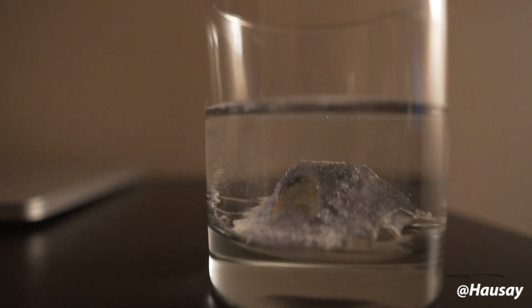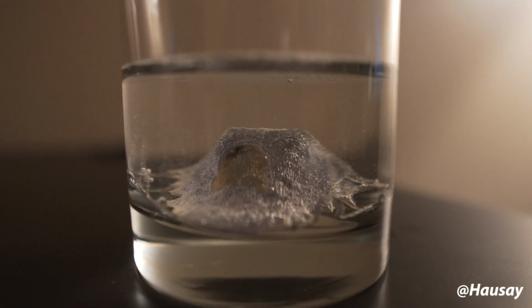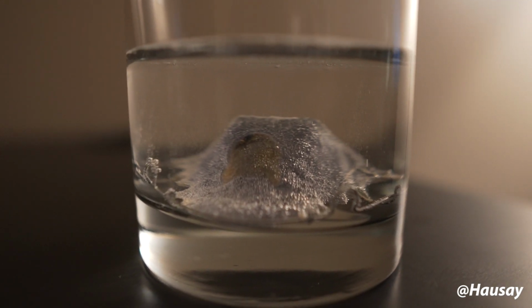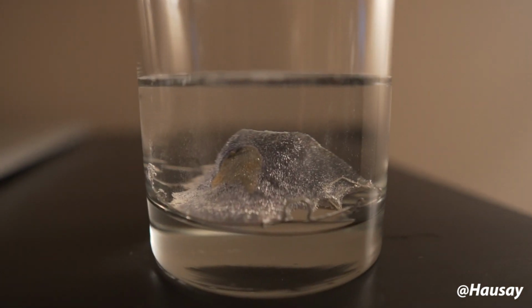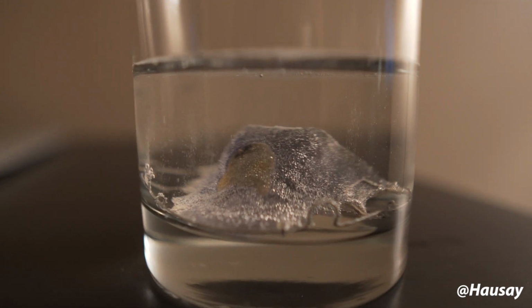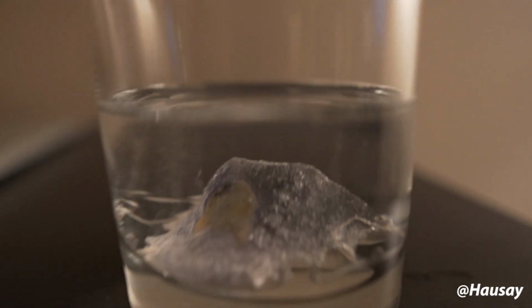Now it's not as good as it was last week. I think last week, because it was so long since I had actually cleaned it properly, it immediately started bubbling up, but that still looks pretty good. I mean, there's definitely lots of bubbles on it. But yeah, those bubbles basically mean that it's killing the bacteria, so it's actually cleaning it. And it looks pretty sick.